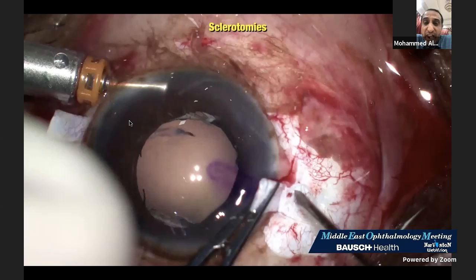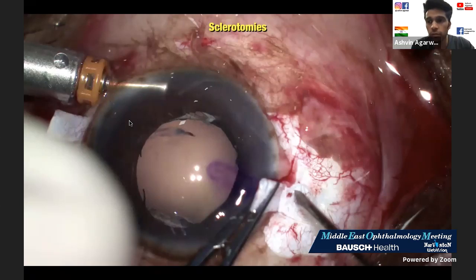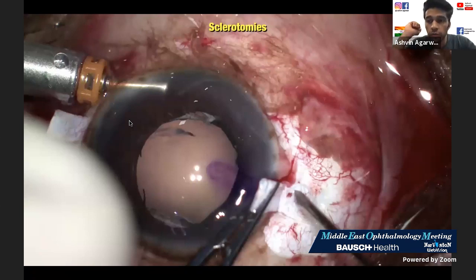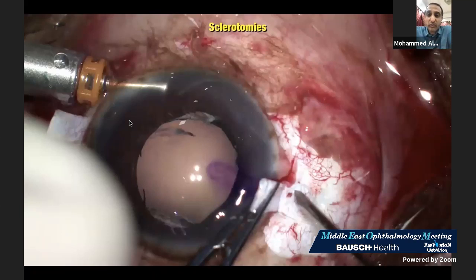You are going behind the iris, right? Where is the location that you are going to stop? In the center or at 2 millimeters? How far from the limbus? So I lift the flap up and I go 0.75 millimeters or 1 millimeter behind the limbus. Okay, that's the point. That's the blue limbus.